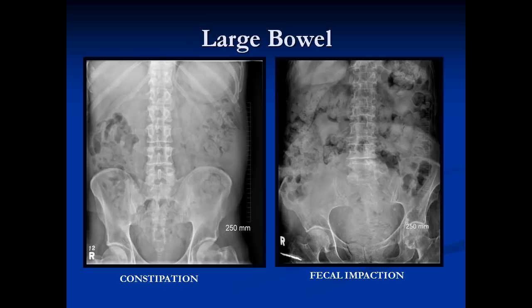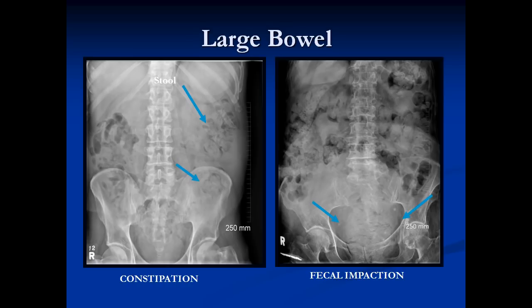When we look at plain films, we often see fecal material. In patients with constipation there's usually more stool than normal — you can see the black air incorporated within white soft tissue like little bubbles. This patient is probably constipated because he has a fair amount of stool. When someone is fecally impacted, they have stool throughout their large bowel and in particular in their rectum. Here the rectum is greatly distended with amorphous material containing air — this is fecal impaction.